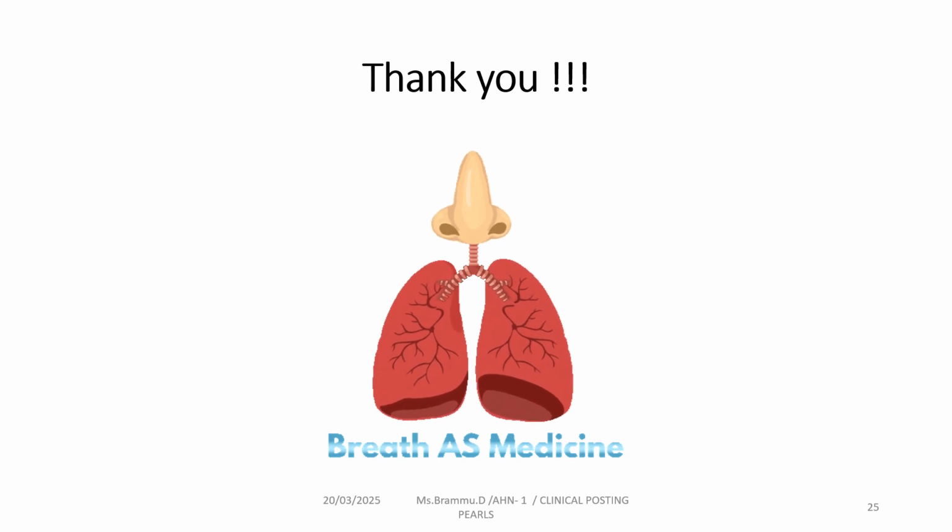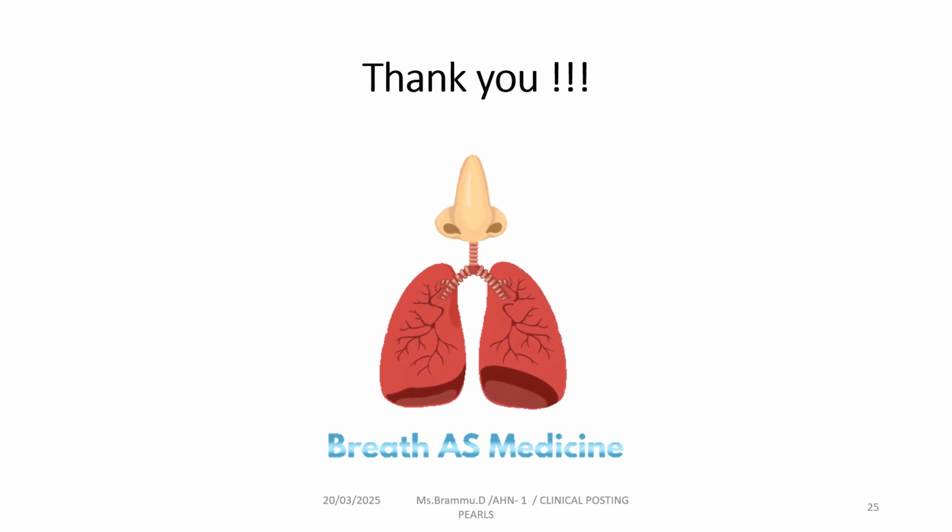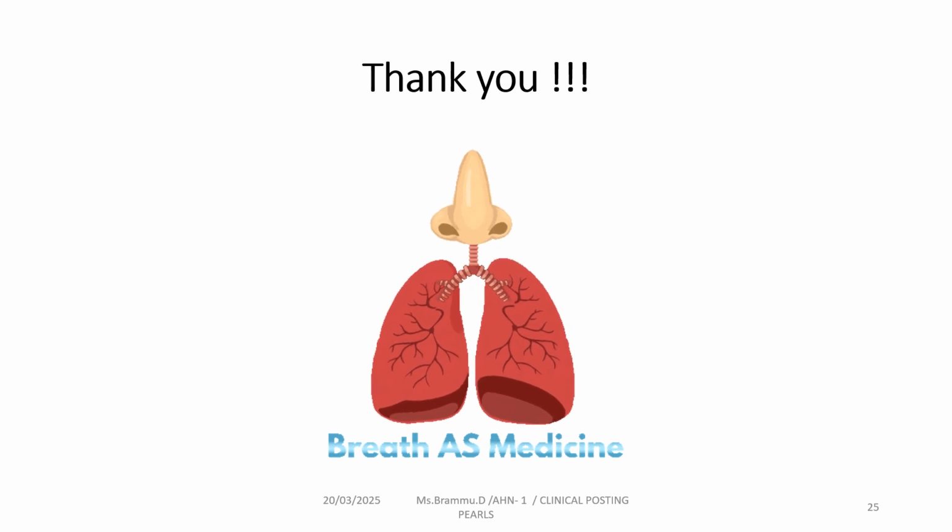Hope you all enjoyed the video, and your insights on chest X-ray are now very well known to you. Hope you are all clear on how to distinguish a normal X-ray from an abnormal X-ray, and hope you enjoyed the video today.